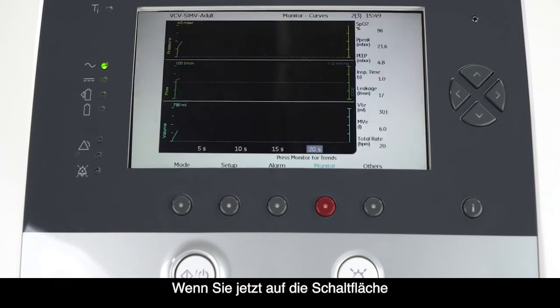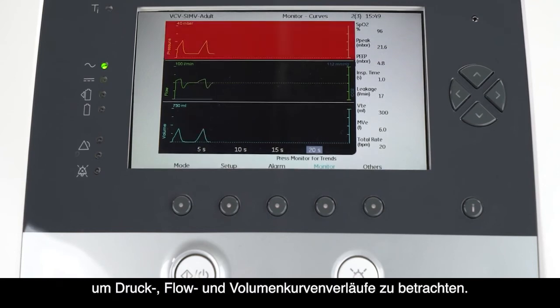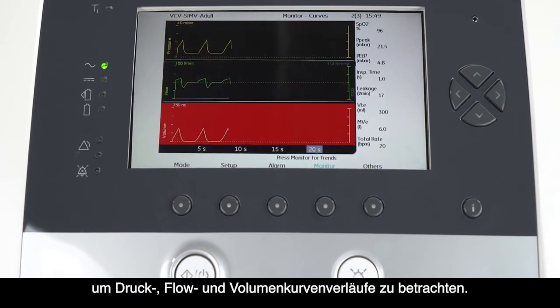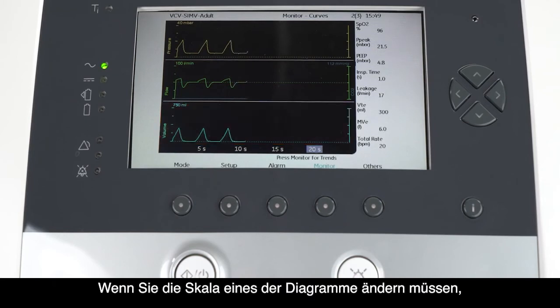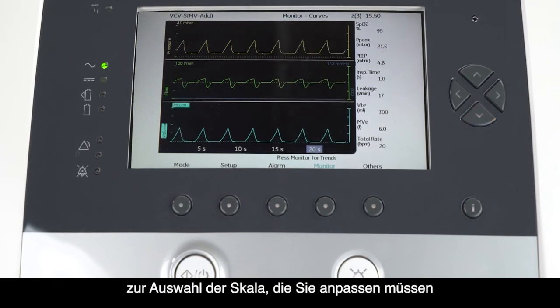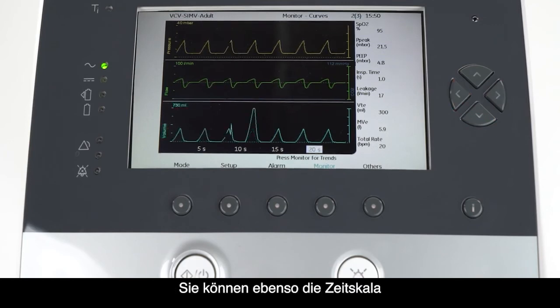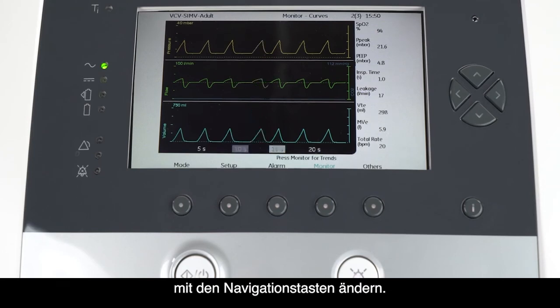If you click the Monitor Function button now, you will be taken to the Curves page to look at pressure, flow, and volume waveforms. If you need to change the scale of any of the graphs, use the up and down navigation keys to select the scale you need to adjust, and the left and right navigation keys to change the scale setting. You can also change the timescale by selecting the timescale you need with the navigation keys.